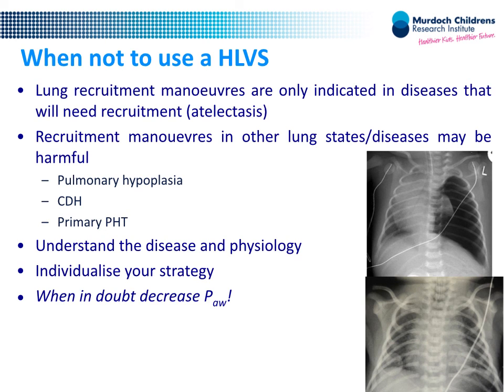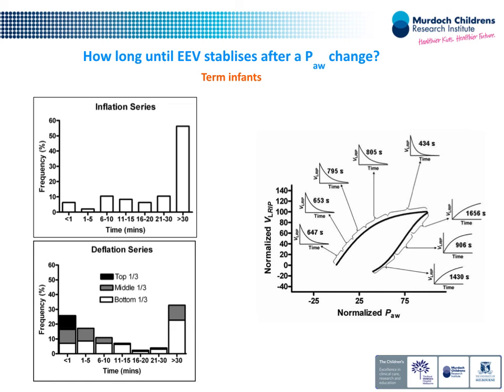David, could you just go back a couple of slides for a second? My reading, returning for normalized mean airway pressure, 75 centimeters of water. No, I've gone very quickly. This is normalised, it's in percentage, and it looks better on my computer. So this is not 75 centimetres of water.